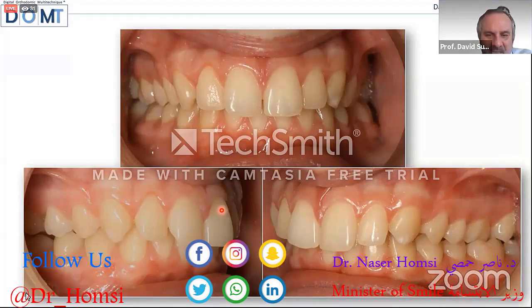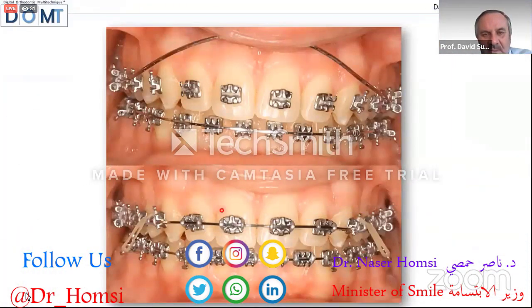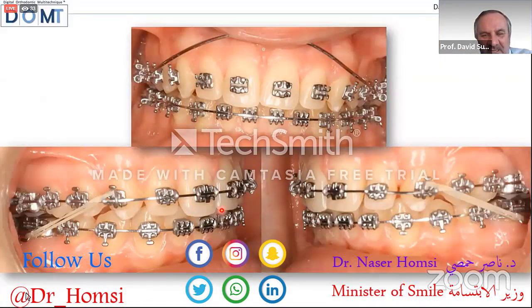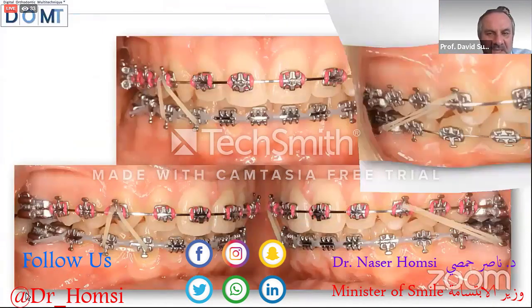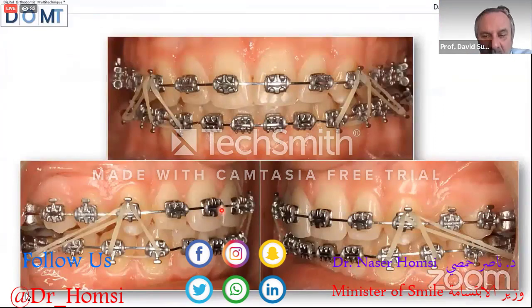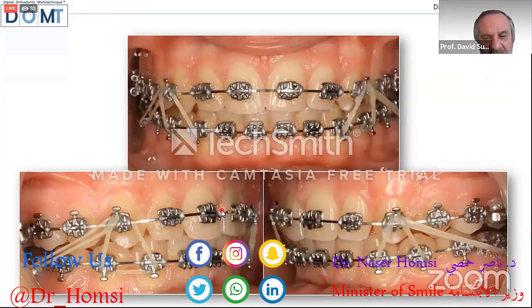And I treated this patient myself. I started with conventional treatment with stainless steel 19 by 25, 21 by 25, and put class 2 elastics with a curve of Spee in the upper, more class 2 elastics, more stripping, more class 2, more stripping, and control of the friction. We are using this type of bracket. This is the Synergy bracket from Rocky Mountain Orthodontics.